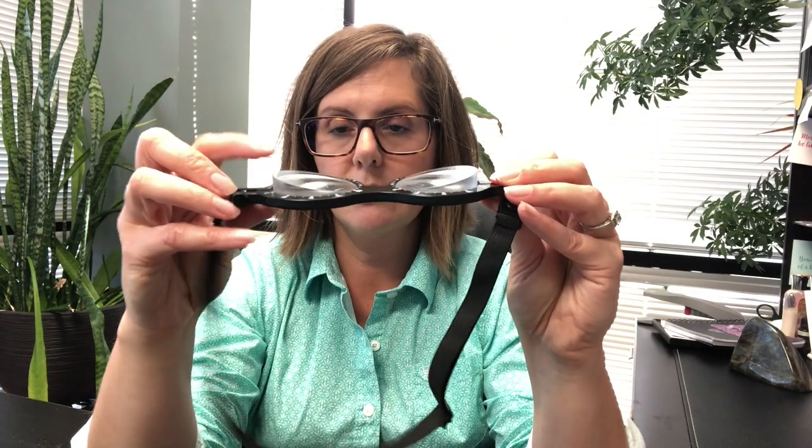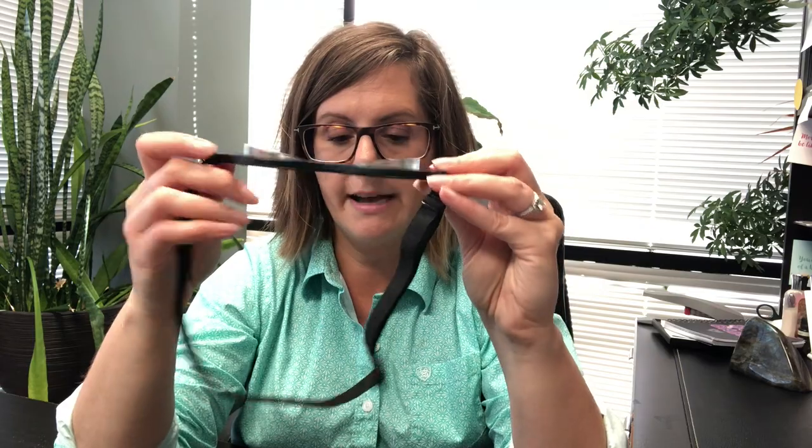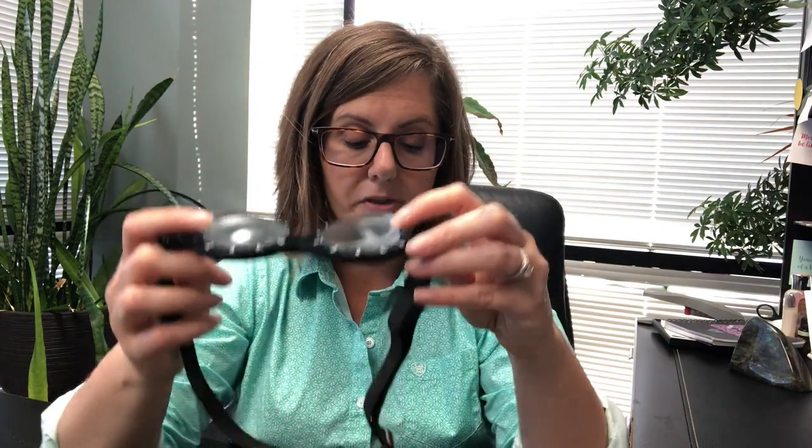Now if I change this around, I'm going to show you what a base-out prism looks like. This is what's utilized for someone who has an esotropia or that eye cross in. So it's a base-in prism used for exotropia and a base-out prism used for esotropia. Here is a base-out prism — the base or the thickness is on the outer side of the lens or the glasses. This is one method that can be done in order to help someone align and try to get them to use the two eyes together better.